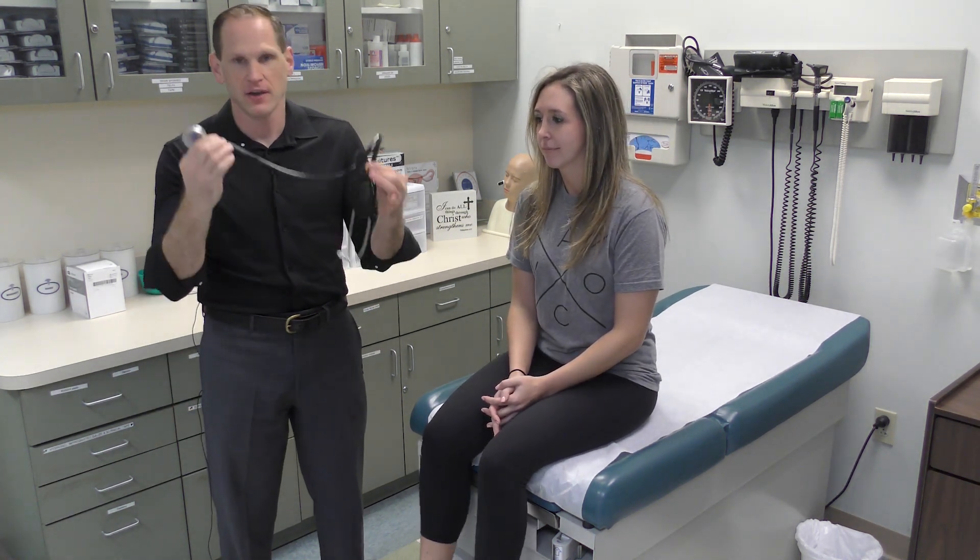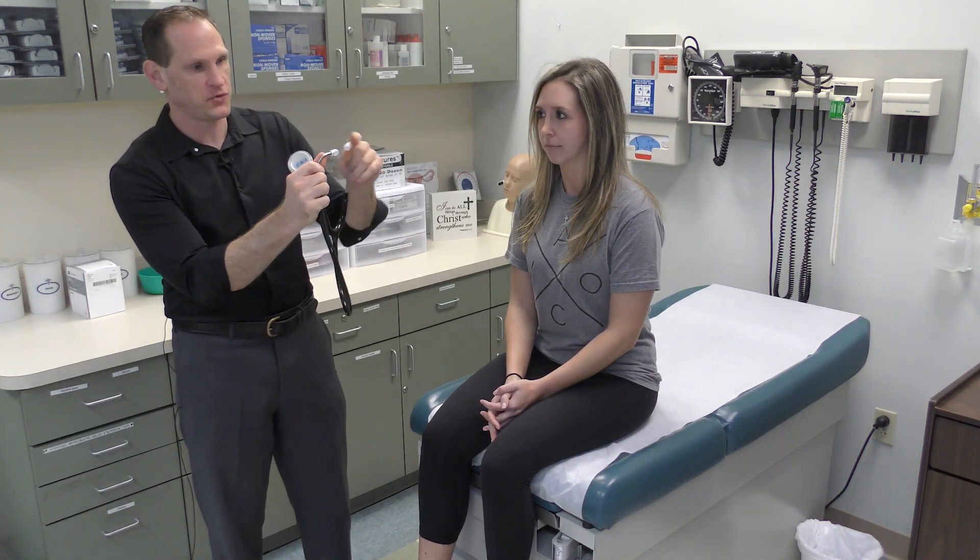All right, today we're going to talk about cardiovascular. Before we talk about the exam itself, let's talk briefly about the stethoscope. The prongs face forward and you put them into your ears facing forward. You never put it backwards. Sometimes in TV shows you'll see people put these in backwards — you don't want to do that because it just looks like you're a poser and you won't be able to hear anything.